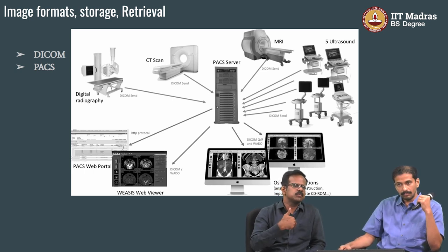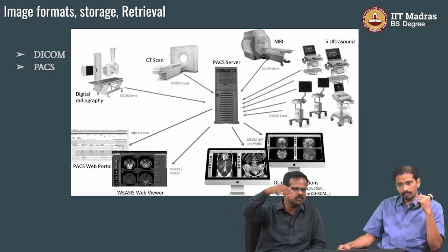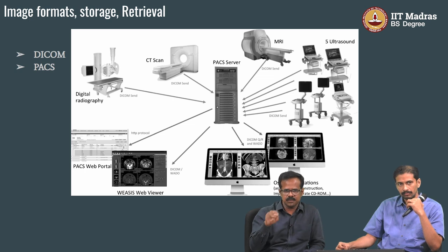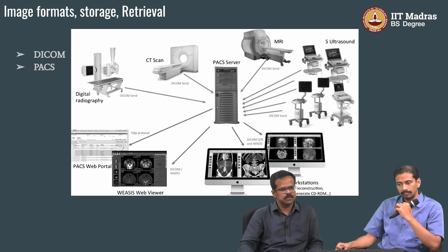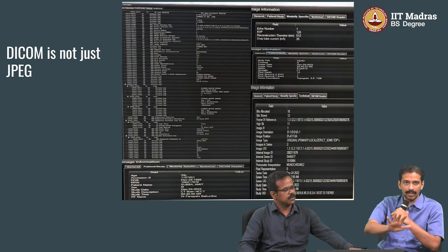We can talk to the PACS through multiple interfaces. Typically, we radiologists don't sit where the scan is done. We sit in another room. The images are sent to the PACS. From the PACS we retrieve and view the images, study them, write a report and send the report back to the PACS. This is also an important thing, because scanning alone is not enough. We have to interpret it, store it, and communicate it to the patient and other doctors. So everything is stored in one place, called the PACS. This image format is DICOM, stored in a particular architecture called the PACS. That's simple.